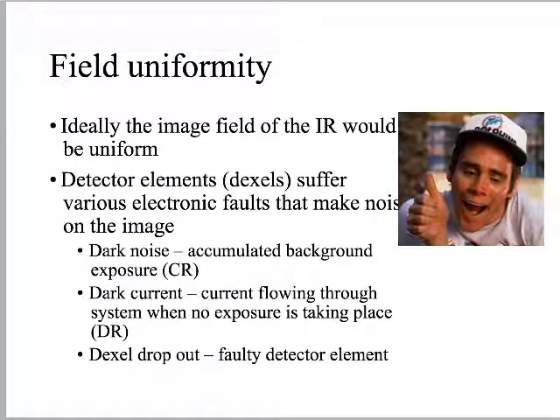So when I think about what field uniformity is, I think about those types of blemishes that I had on my face at that time. Imagine if the same kinds of things were happening on your X-ray picture. You would want to correct for that prior to applying any kind of makeup, right? So before I put any kind of lipstick on this guy, for example, I've got to cover up a whole lot of stuff or the lipstick's not going to make any sense. It's actually going to wind up highlighting the blemishes, right?